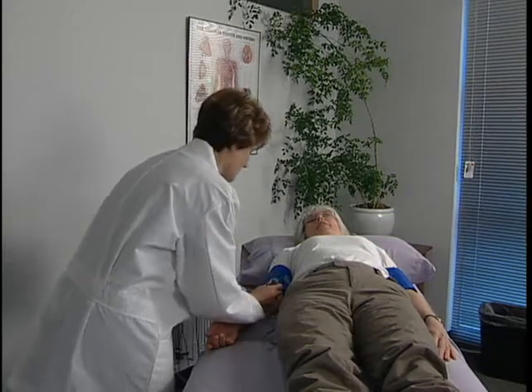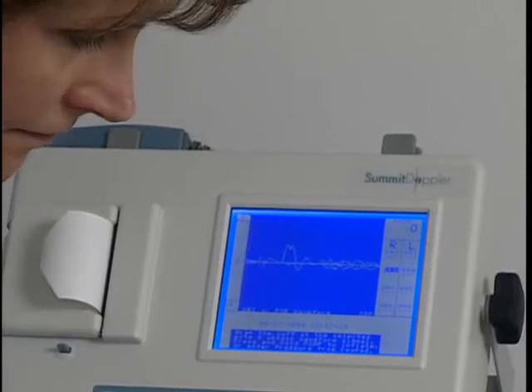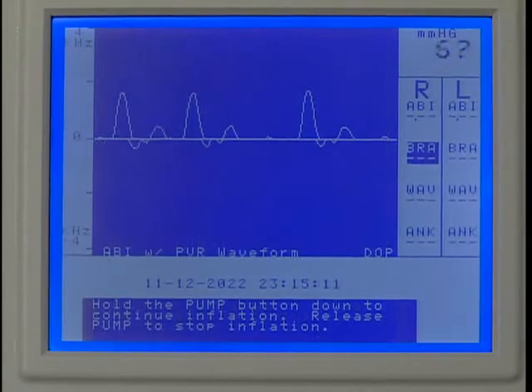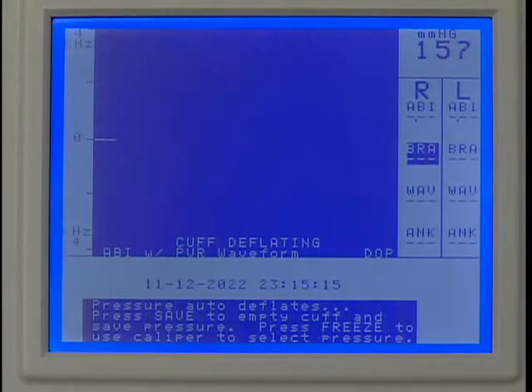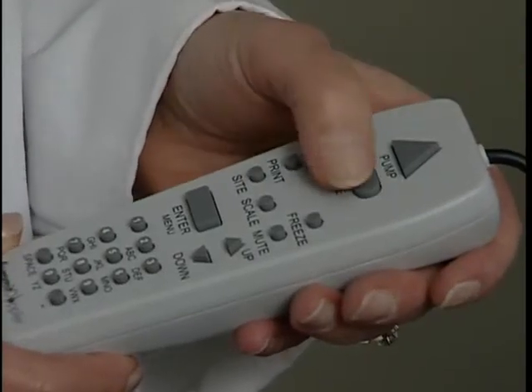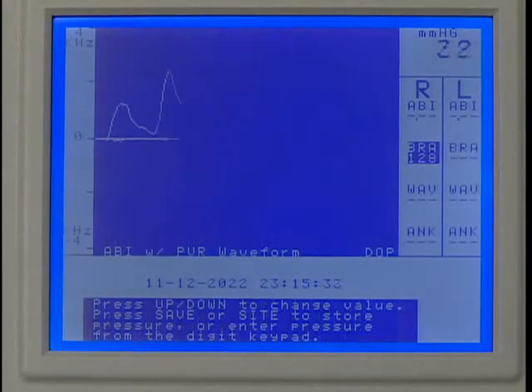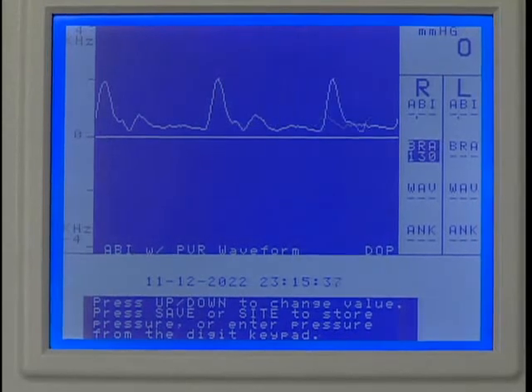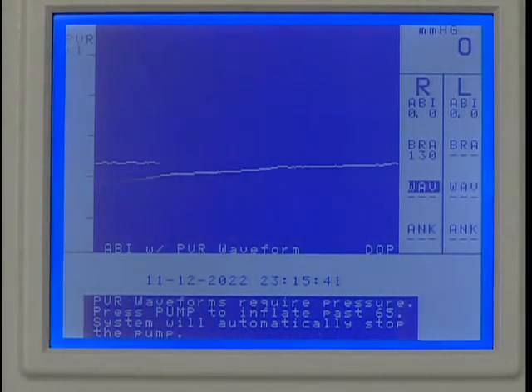Use the Doppler probe to listen to the blood flow while holding the probe steady on the artery. Press and hold pump to inflate to about 20 millimeters of mercury above the occlusion pressure. Release pump and the cuff will automatically start to deflate. Press Save when you hear the first pulsation return. If you were late pressing Save, adjust the pressure reading using the up or down key. Press Save to record the systolic pressure and the marker will move to the next protocol location.